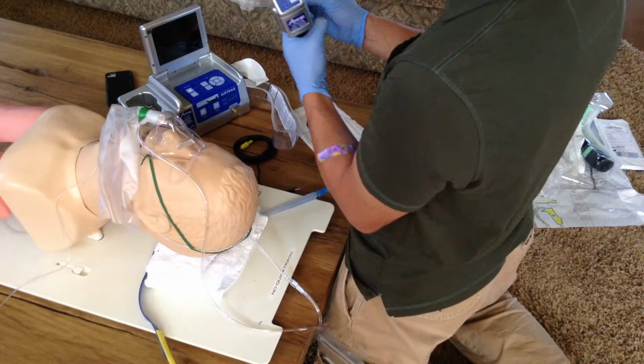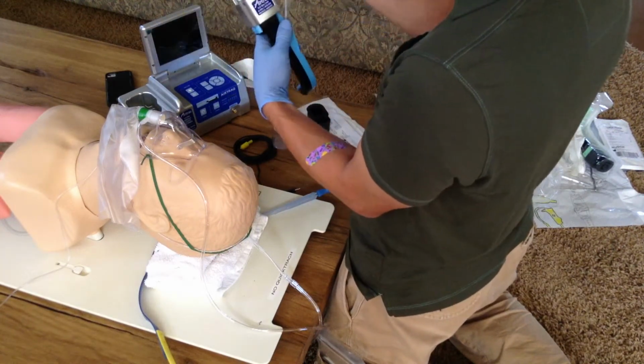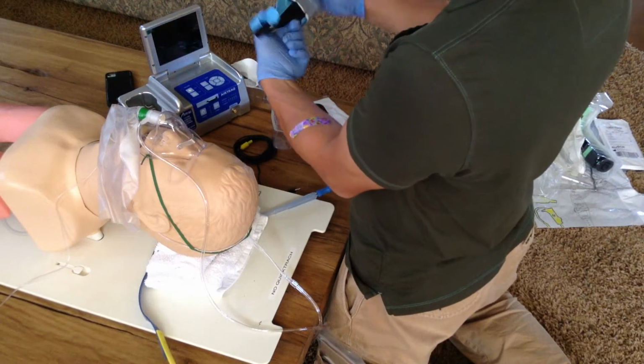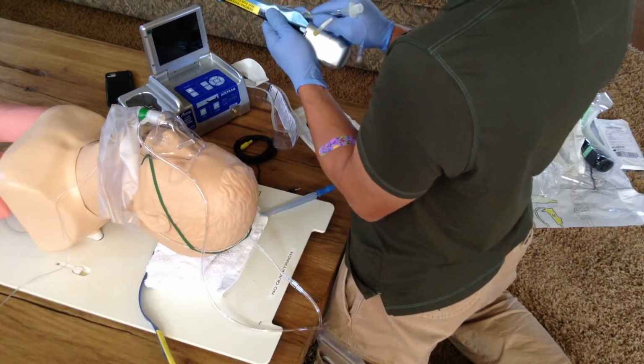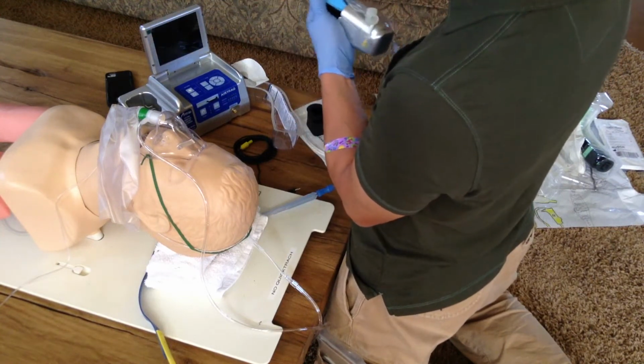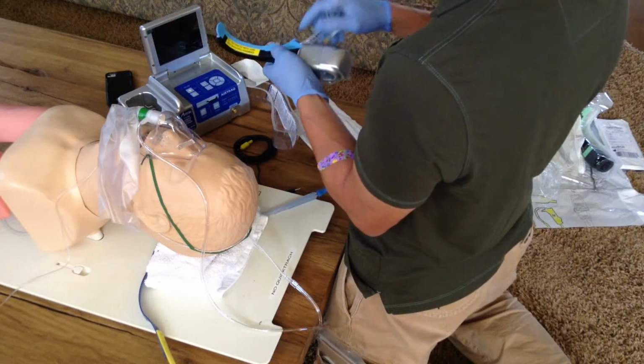You lube up your tube so that the balloon slips out of the channel easily there. And also remembering that if you deploy the balloon out of the channel, you can't pull it back in because this groove might damage the balloon. So you have to pull it back out and reinsert.